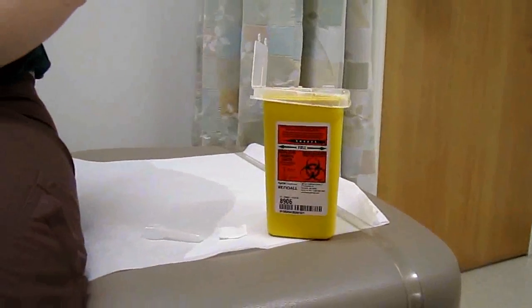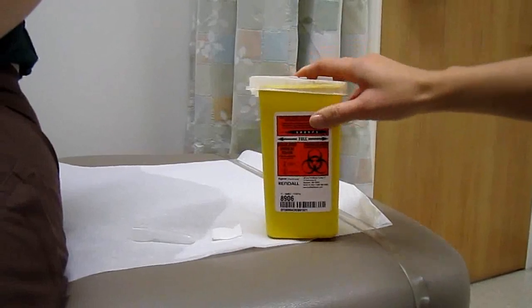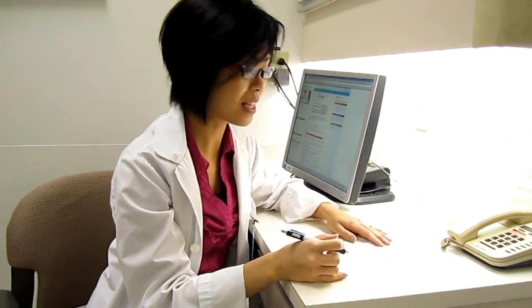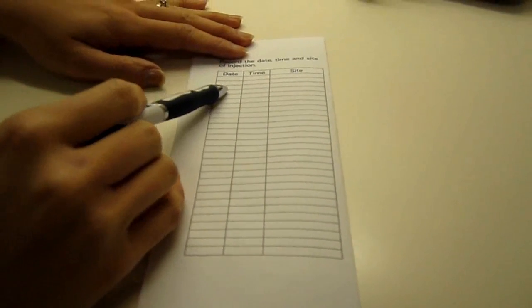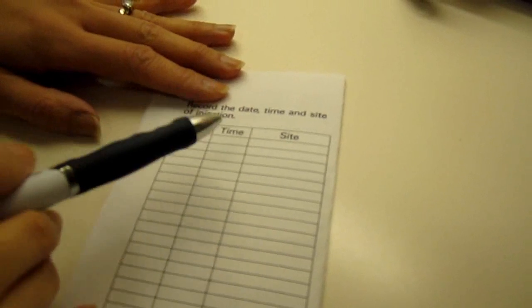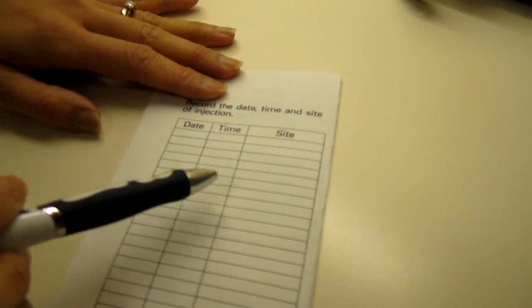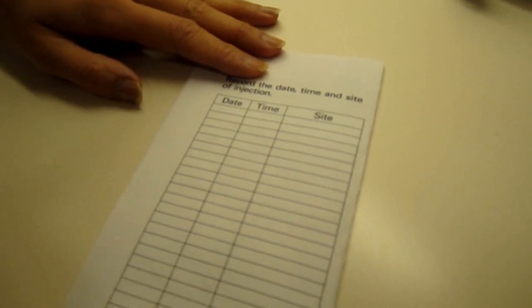When your sharps container is three-quarters full, that means it's time to ensure that it's locked up and take it in to your nearest pharmacy for proper disposal. Now that we've completed our self-injection, we're going to finish up with our last step and that's recording our injection. You should gather some kind of a log — here we have one that shows our date, our time, and our injection site. This way you can keep track of when you last did your injection. It's important to know what site you did because it's important to rotate our sites. Rotating our sites avoids scar tissue buildup and in the end it will allow for better absorption and better effects of your methotrexate. If you have any other questions feel free to contact your rheumatologist or visit our website at edmontonrheumatology.com.